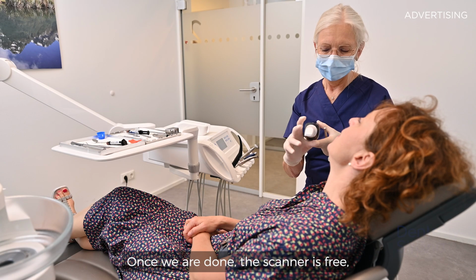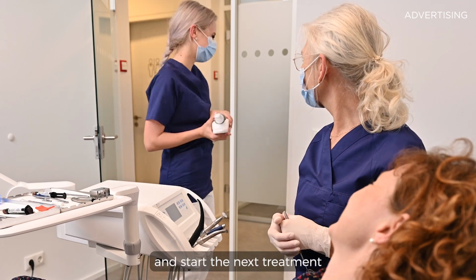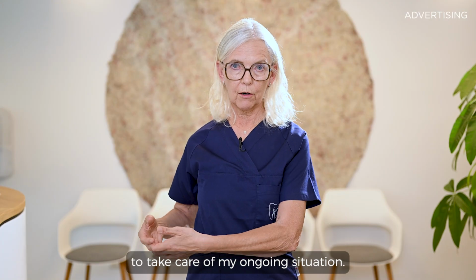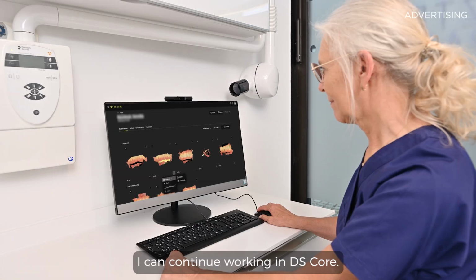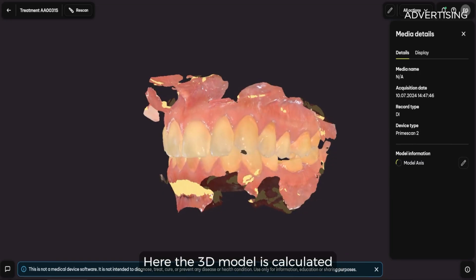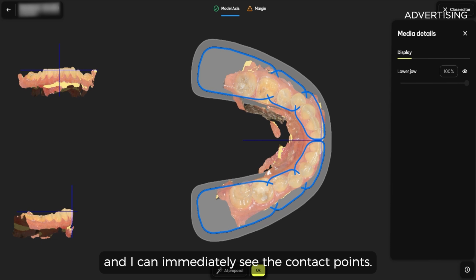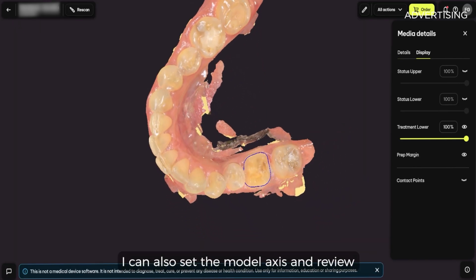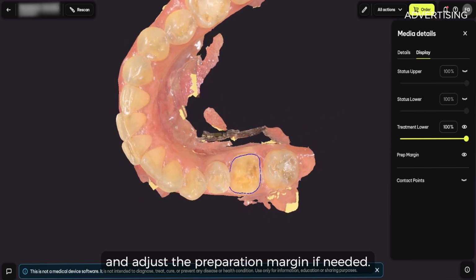Once we are done, the scanner is free and my staff is able to take the scanner and start the next treatment, while I am free to take care of my ongoing situation. I can continue working in DS Core. Here, the 3D model is calculated and I can immediately see the contact points. I can also set the model axis and review and adjust the preparation margin if needed.